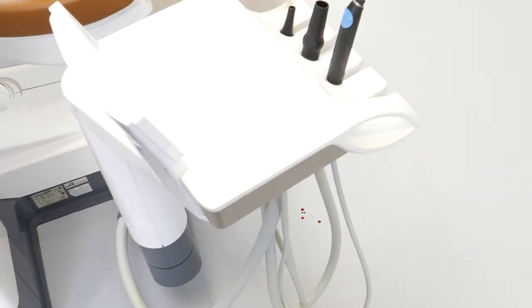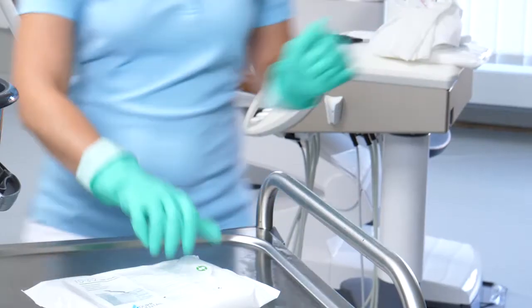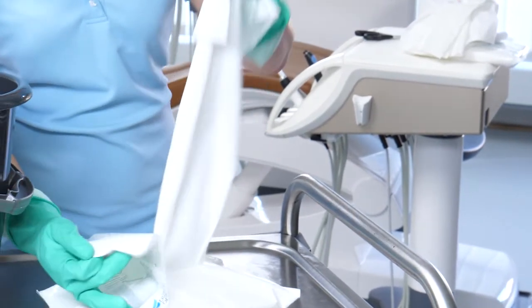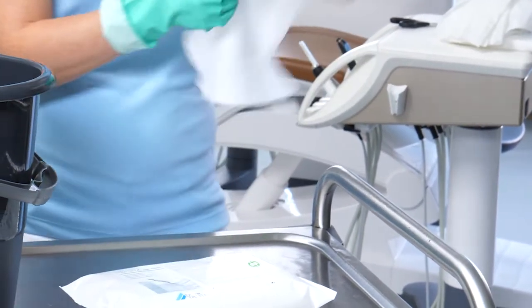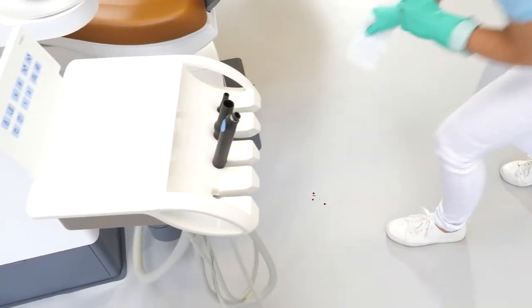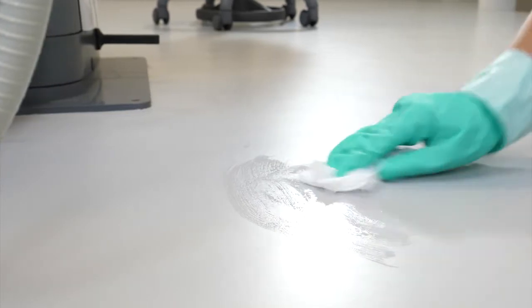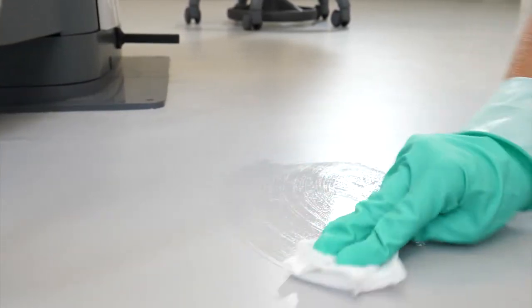To disinfect the entire surface completely, first remove any dirt or contamination, e.g. blood or secretion, from the floor. Use a disposable wipe saturated with disinfectant, e.g. FD312 from DÜRR Dental for this purpose, and dispose of the wipe. Then disinfect the surface completely.